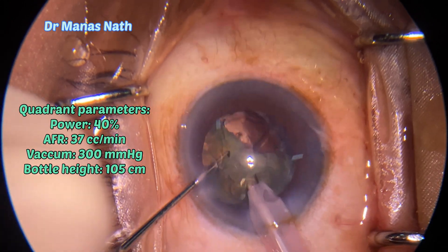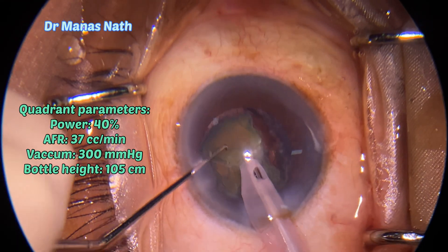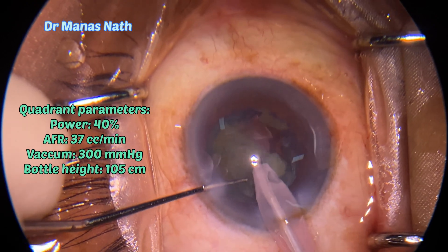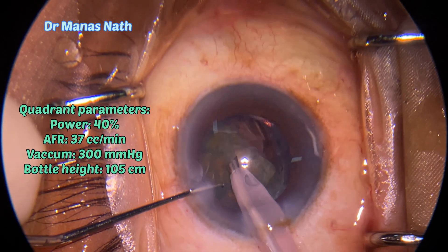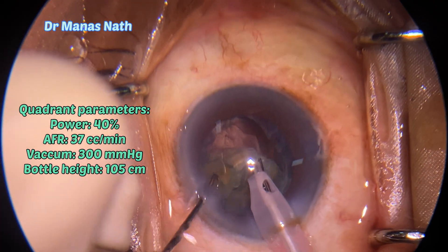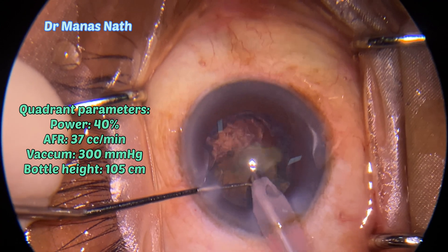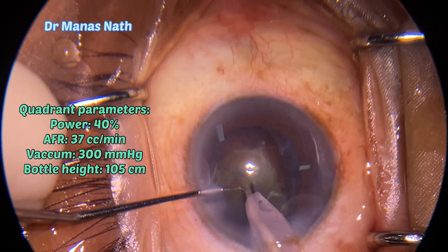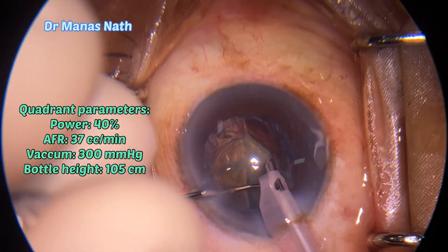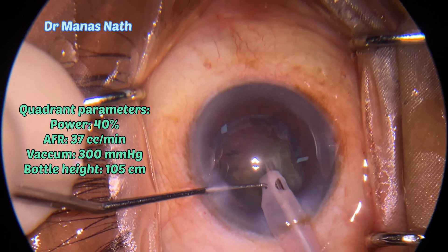Sinsky hook, and continued quadrant emulsification with the parameters mentioned here. I've kept the power relatively on the lower side. The pupil size has maintained well — it did not come down.